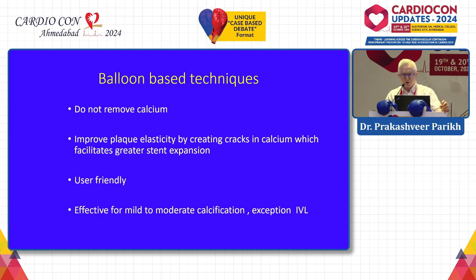The balloon-based techniques do not remove the calcium, but they improve the plaque elasticity by creating cracks in the calcium, which facilitates greater stent expansion. The advantage of balloon-based techniques is that they are user-friendly. You don't require special training to use those devices. But they are effective only for mild to moderate calcium, except IVL, which is effective for heavily calcified lesions also.